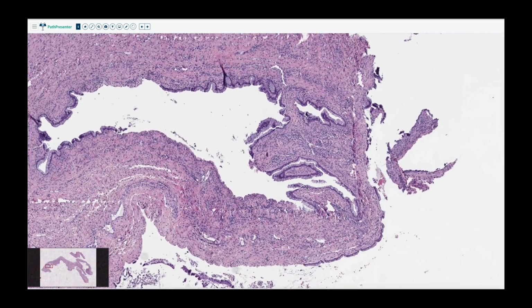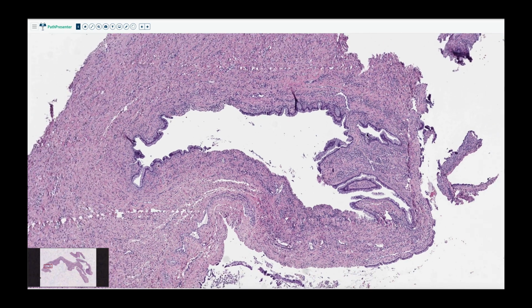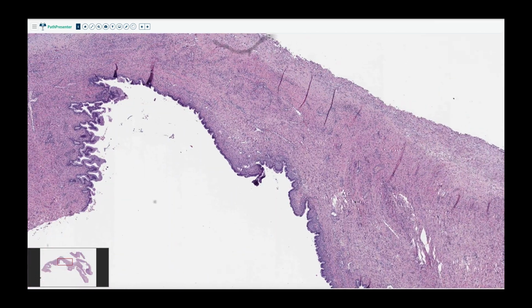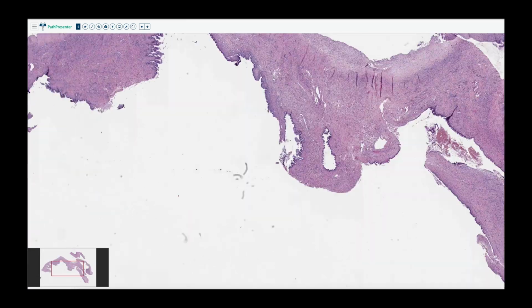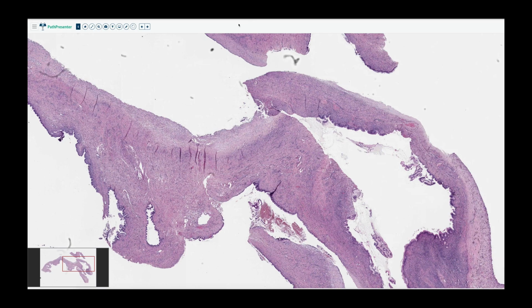So in contrast to the serous cases, which had cilia, these have that nice intracytoplasmic mucin and no proliferation here, so no stratification. The cells are not stacking up on top of one another. There's nothing complicated going on, no borderline architecture. So this is a nice example of a mucinous cystadenoma, or I suppose if you wanted to call it a mucinous cystadenofibroma, because there's a little bit of fibromatous proliferation, nobody would argue with you. Those are both benign diagnoses and sort of exist on a continuum.